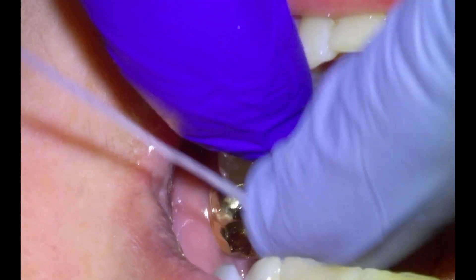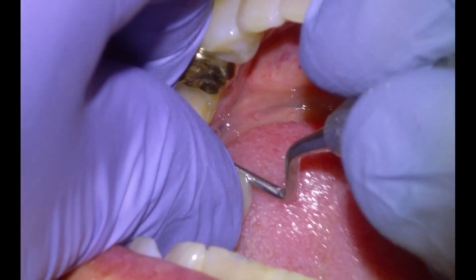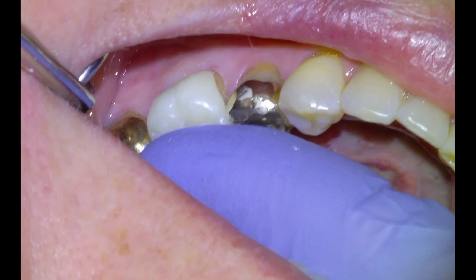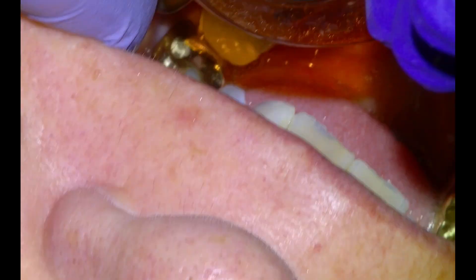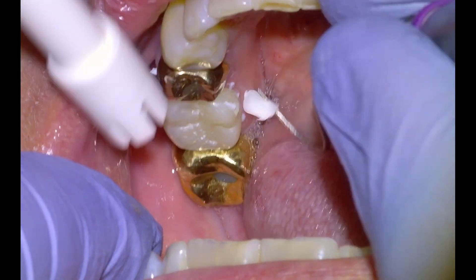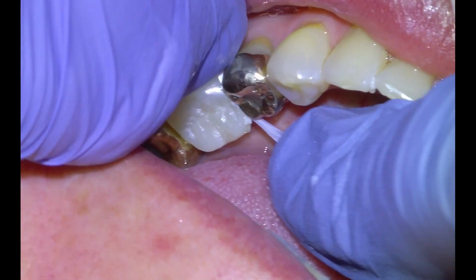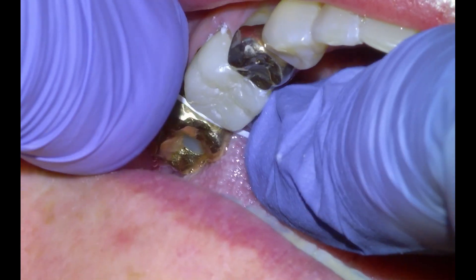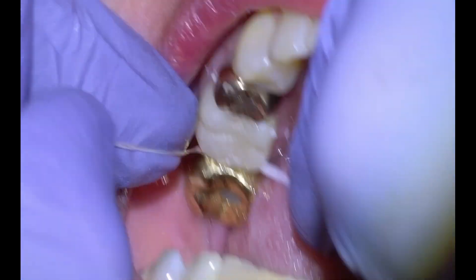We're going to do a dry fit with the crown, check the contacts, check the fit, and check the occlusion. Then we're going to dry off the interior surface, treat it with ethanol, and seat it down. I like Panavia SA — we're going to tack cure it and then clean it up. I find Panavia SA a lot easier to clean up than 3M Unicem II. Once we've cleaned up most of our cement, this is going to be a finished job and we would typically anticipate a lifetime of service out of a root canal and crown like this.